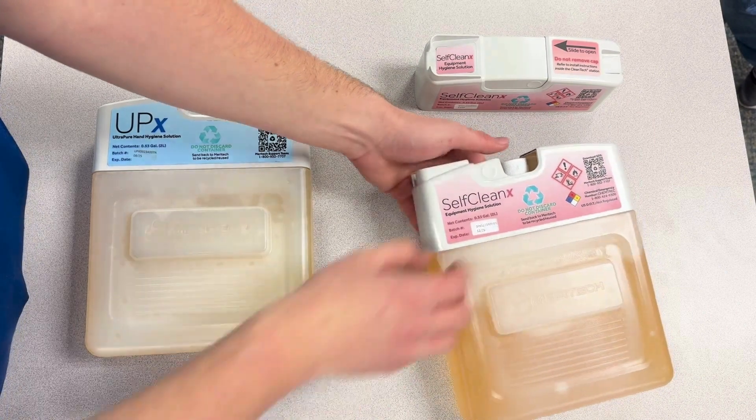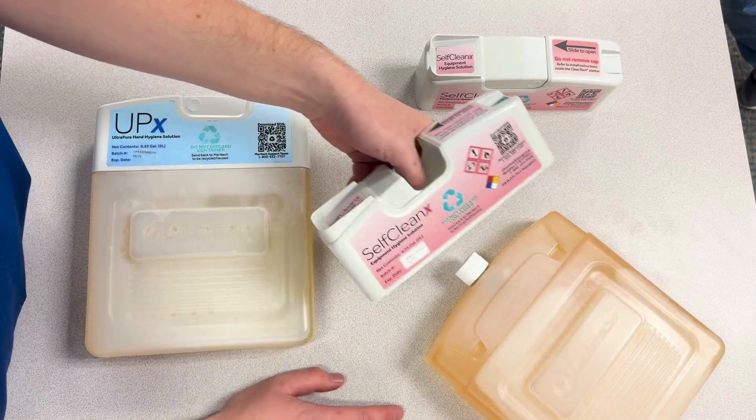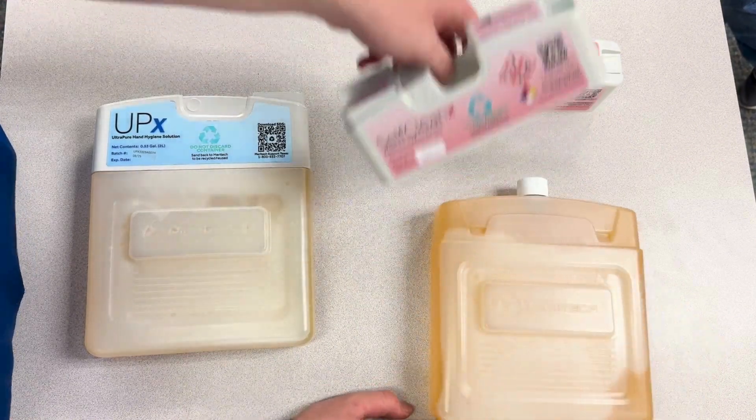Do the same thing here — open the top, gently push it out, and pull up to remove the cartridge top off the cartridge.